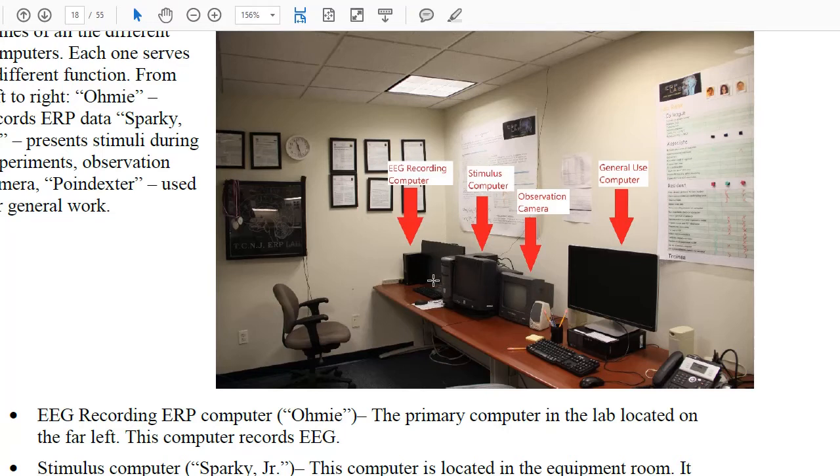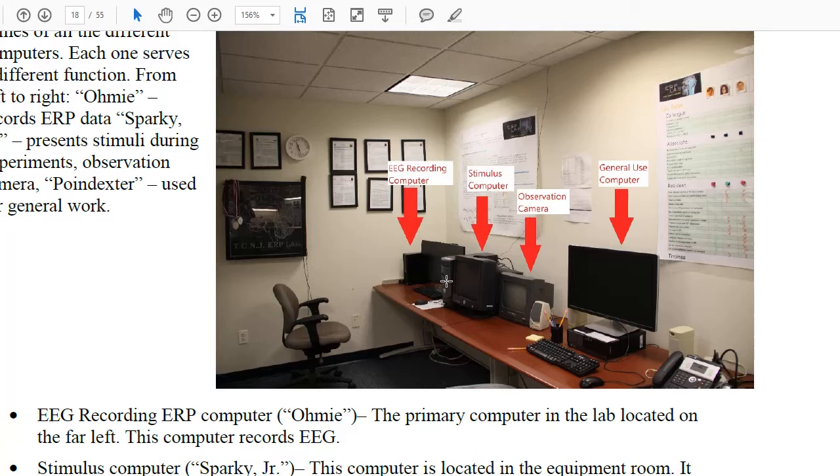The stimulus computer will show stimuli, so it will show pictures, words, whatever is part of the research study. And it also sends event codes to the amplifier so we know when particular events were presented on the screen. I'll show you how that works next.